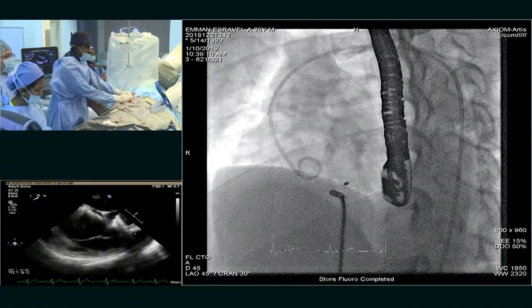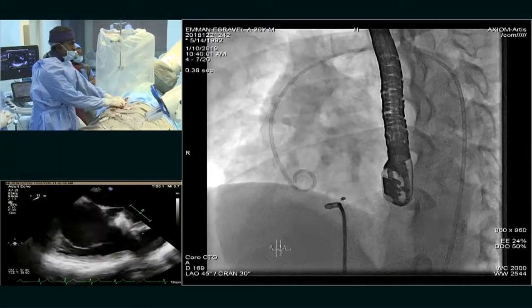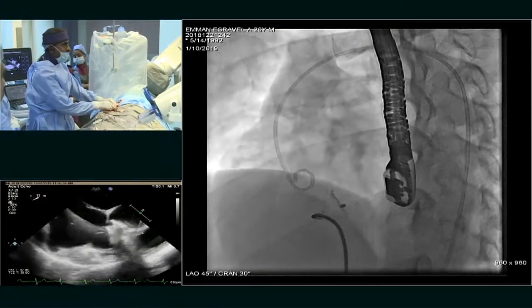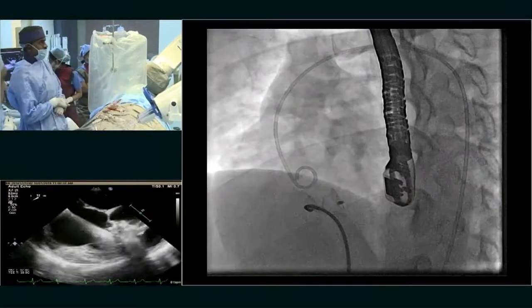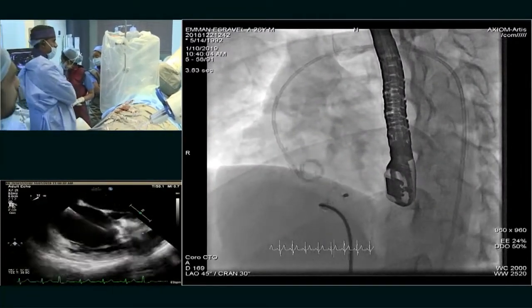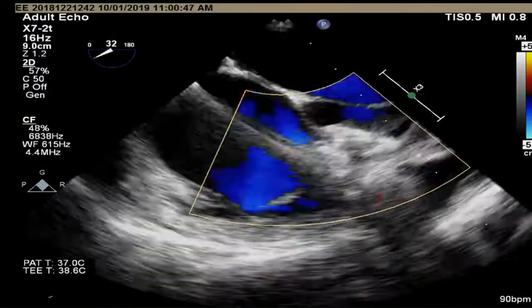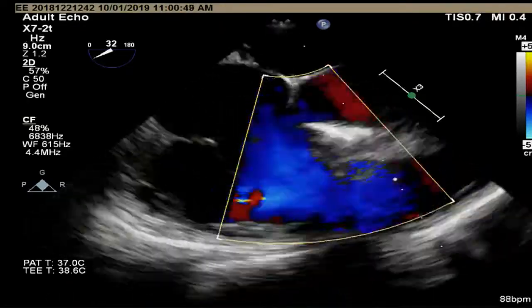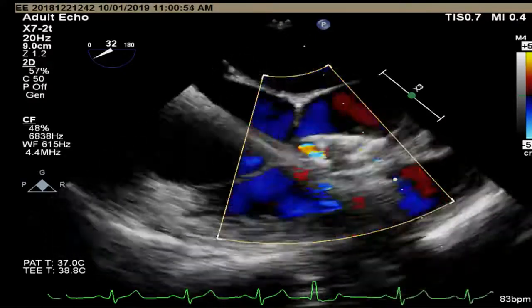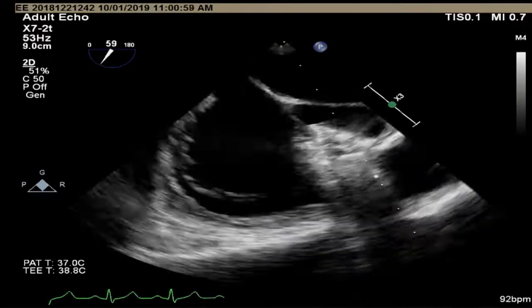Fluoro store. Yeah. So right now I will go on cine. Now, Ramya, you see the echo also. So now we have positioned the device. So echo big, yeah. Color now. So we can appreciate some sort of tricuspid regurgitation right now, but I have my rigid cable across. And now let us see one LVOT long axis view for the aortic valve.